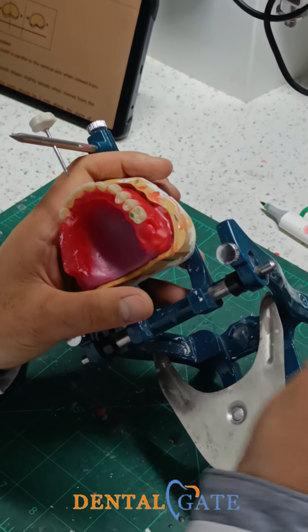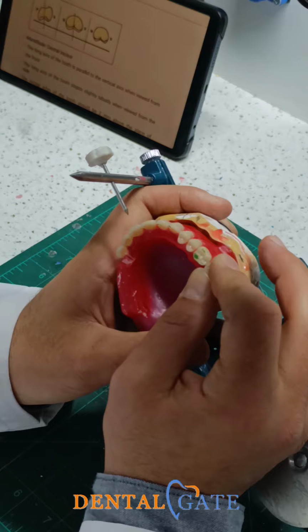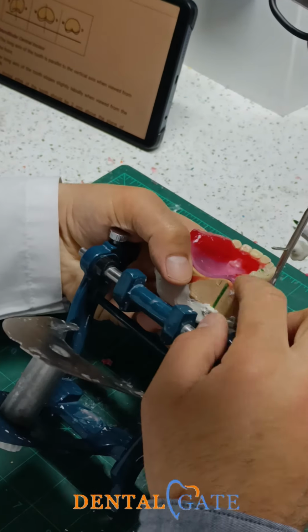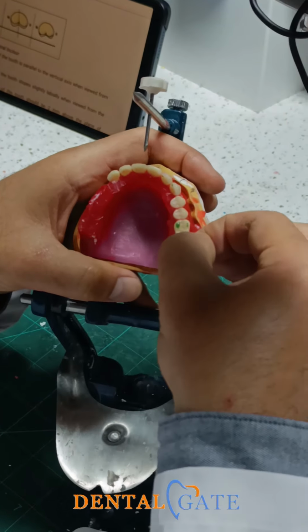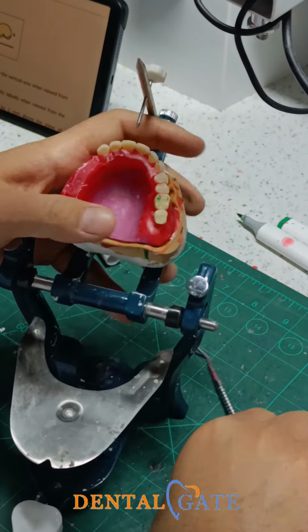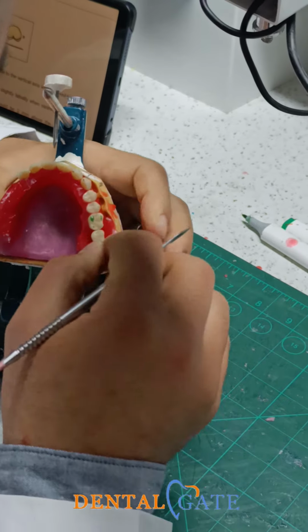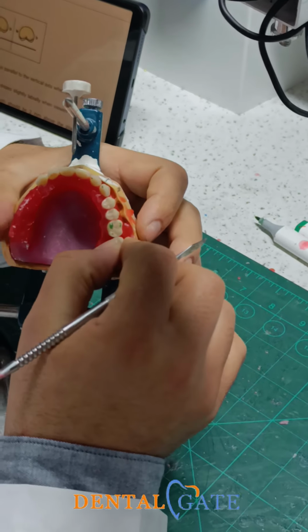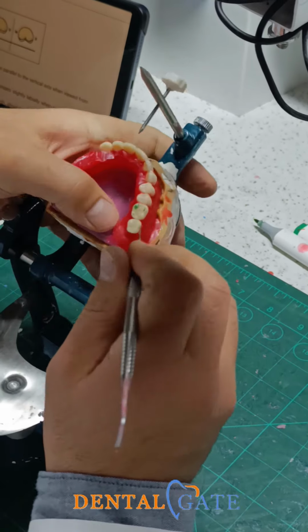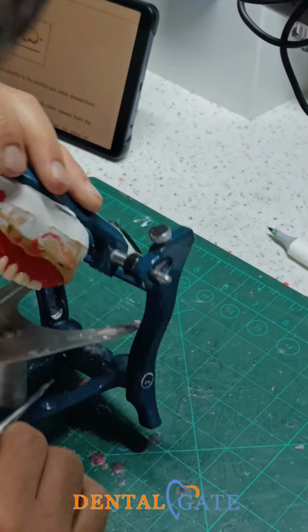Make adjustment, okay? This is upon the crest of the ridge now, within the same tilting. There is no cusp touching the table, but I will preserve the tilting now.